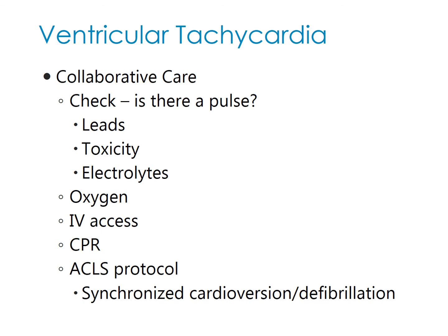You do not need to know that. Just again, remember your ABCs. I always tell you guys that, and look at your client. Don't just look at that monitor and jump to conclusions. And then a lot of times, the lead could be off or misplaced, so you want to make sure those are correct. And then drug toxicity is a big one, and electrolyte imbalances.